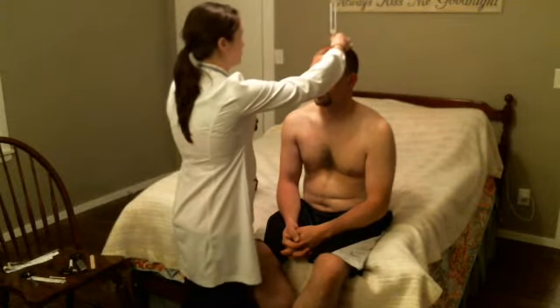We're now going to perform the Weber test. I'm going to take my tuning fork and put it on top of his head. Kurt, can you tell me if you can hear this in both ears, please? Yes. Good. Now I'm going to check the Rinne test for auditory function as well, just as I checked the last.